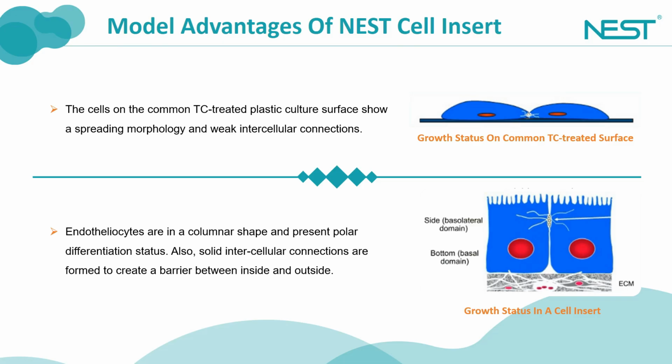What is cell polarity? The 3D morphology of cells, especially the ones within tissues, is often not random. Instead, they will present axialization, namely the morphological property of the molecular structure in the cells distributes unevenly along a certain axial direction or several axial directions. Then these cells have polarity.